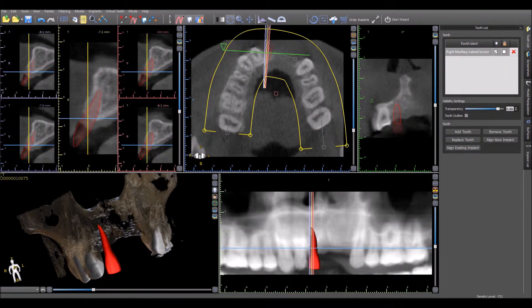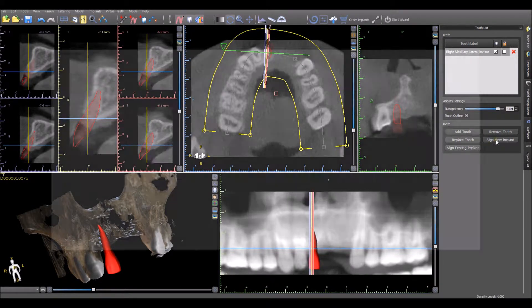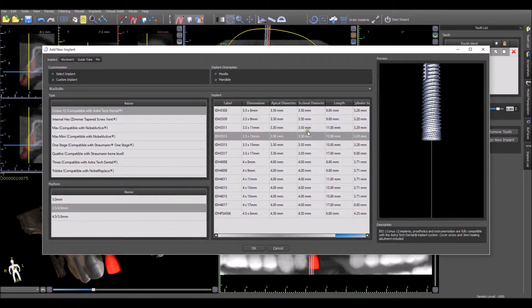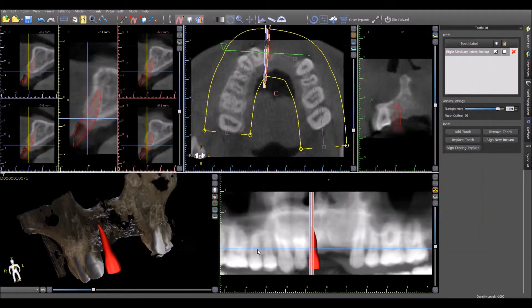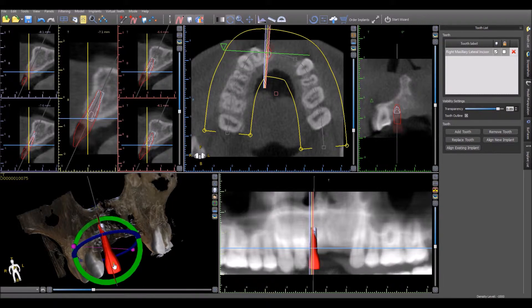If you have already placed a virtual tooth and you would like to have an implant that would support the virtual tooth automatically, simply click Align New Implant. Select the desired implant, press OK, and the software automatically adds the implant to the treatment plan to support the virtual tooth placed.